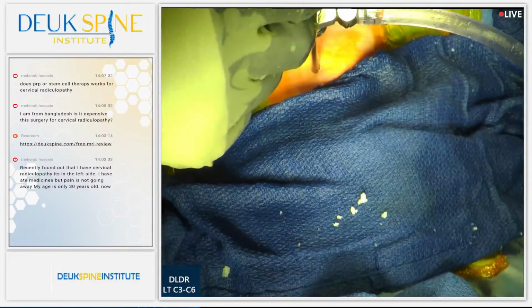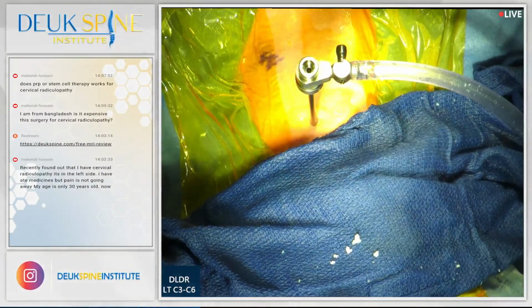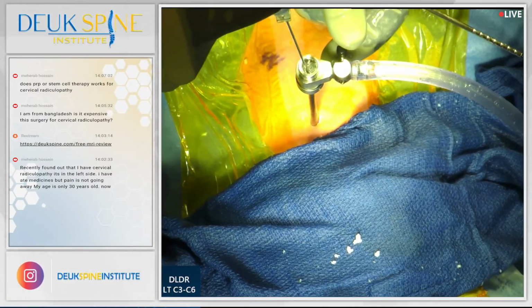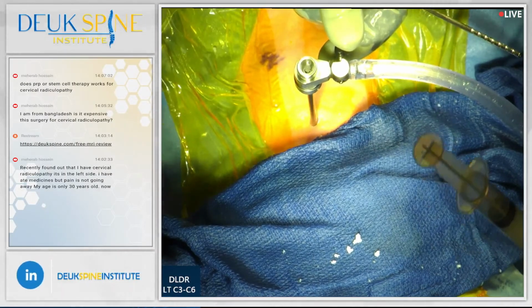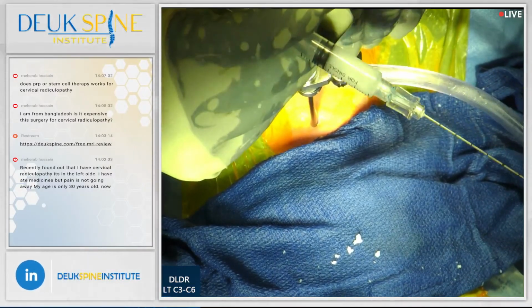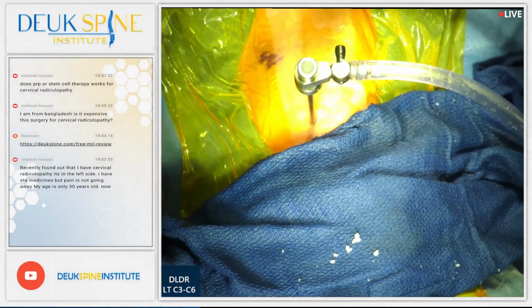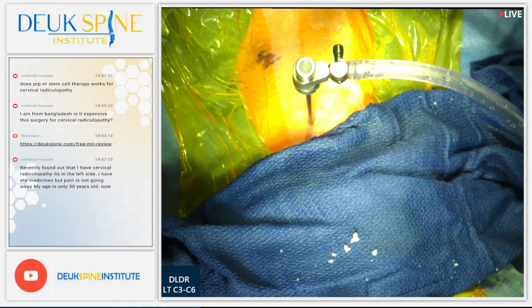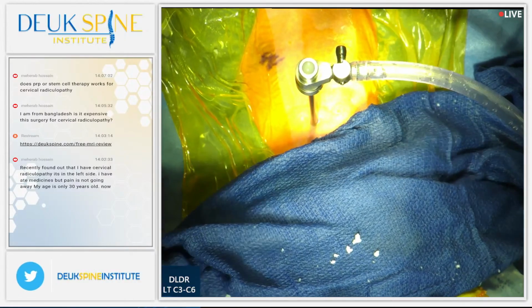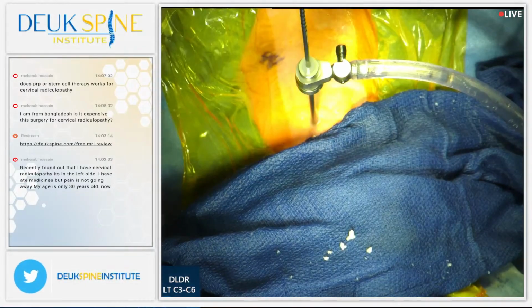So I use the laser to release all the pieces of herniation. And I sometimes use the grabbers or the irrigation and suction to remove them. But they must be removed, and that's what we do. We remove them. I think she's going to do great. Got one more to do. Let's bring the fluoro back in.